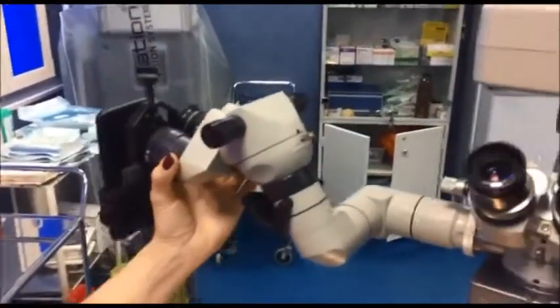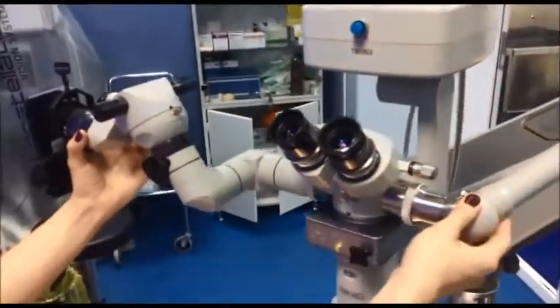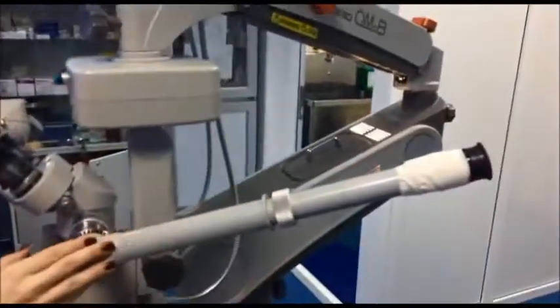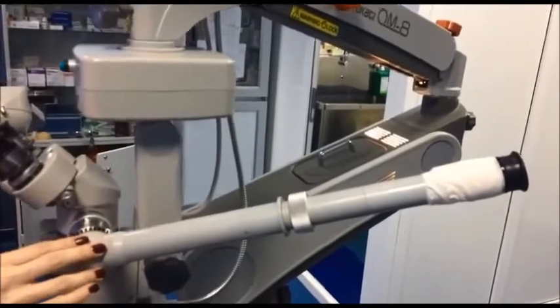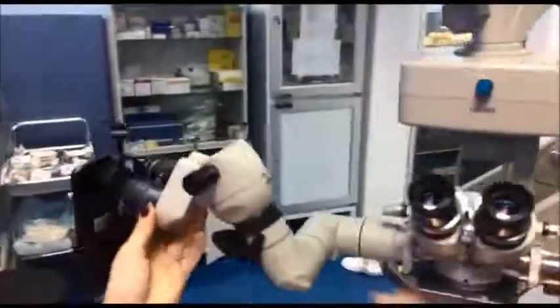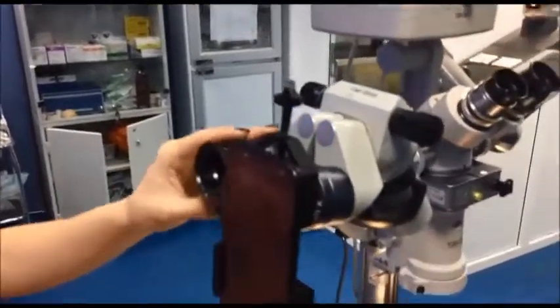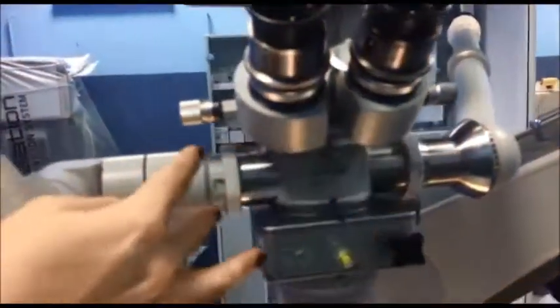We also have on this one the same fitting that, by rotating, will rotate the image on your smartphone. So you have the monocular teaching head on one side, the binocular teaching head on the other side, and right in the middle the beam splitter.